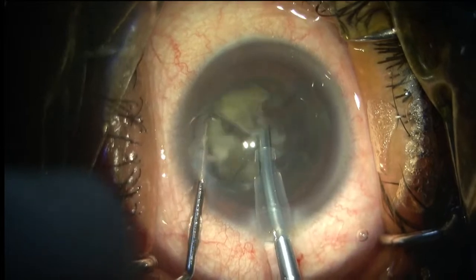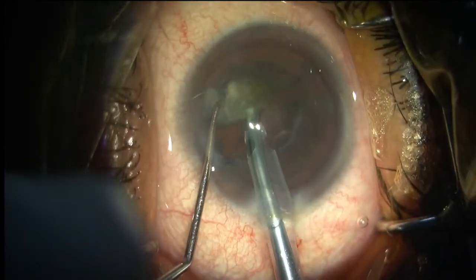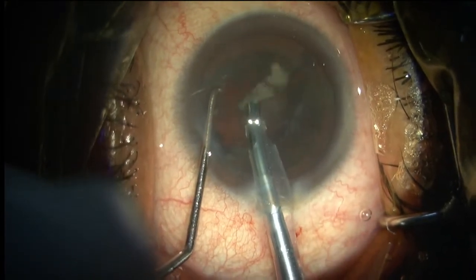You can see the chamber is absolutely stable, while flow rate settings are quite high.